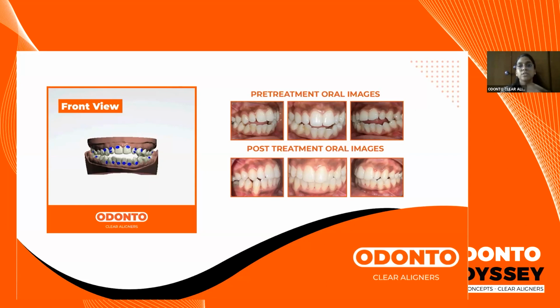Have mild, moderate, and severe categories. If it is in a severe category, then you can always consider these multiple modalities and try to combine them to offer the best for your patient. So this is one of the open bite cases.